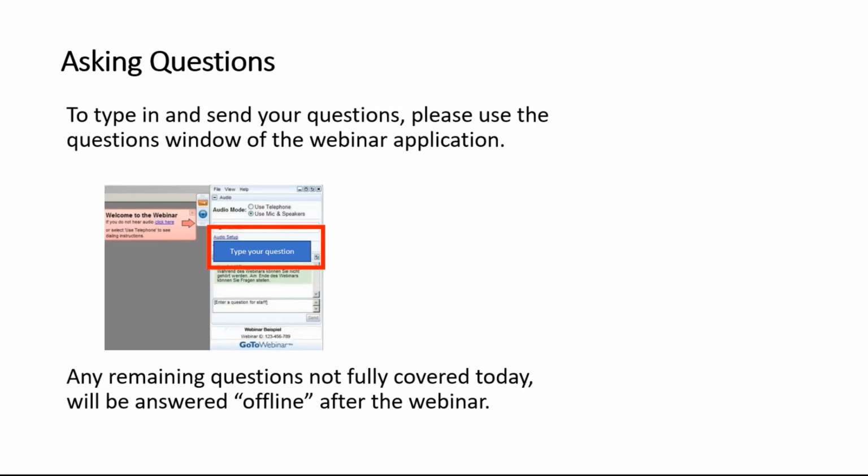Okay, so for the majority of cases, you can perfectly work with the en face OCT approach, correct? Yeah, you're correct, because we use on-face mode as the primary choice to plan any laser procedure, for focal laser for diabetic macular edema and central serous chorioretinopathy. And for patients with CSCR, we perform FA only if one treatment was unsuccessful using the en face approach. But as I said, this number is not very high. I would estimate this case is not more frequent than 20%.